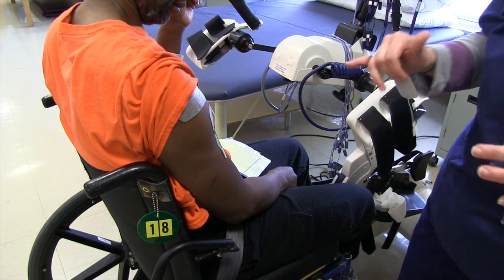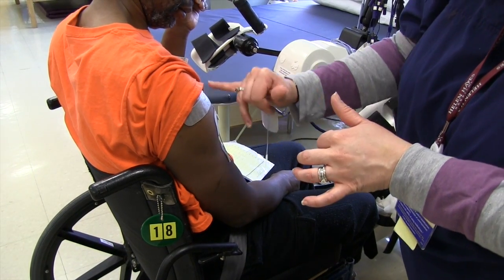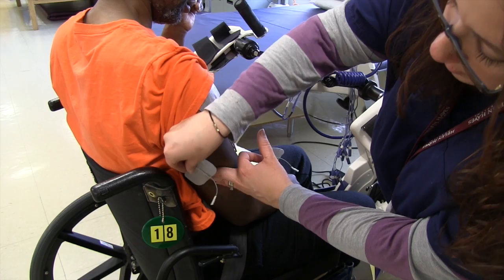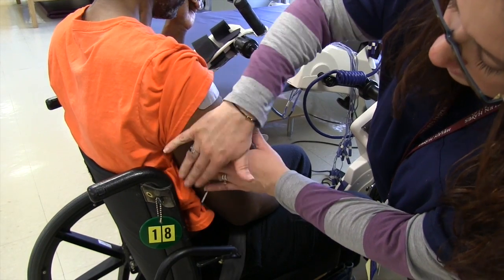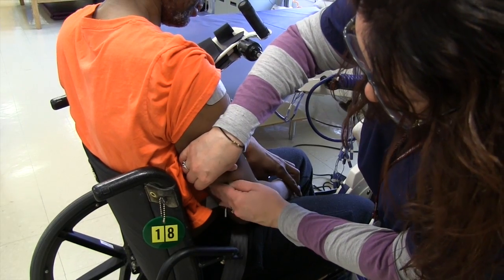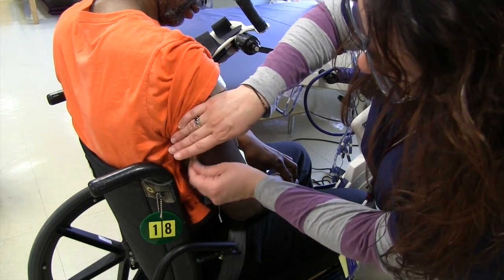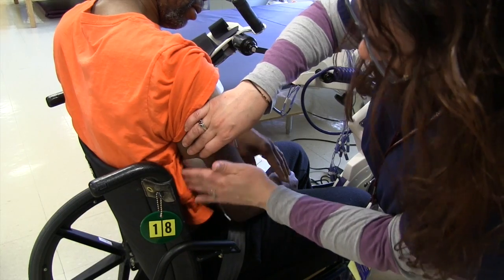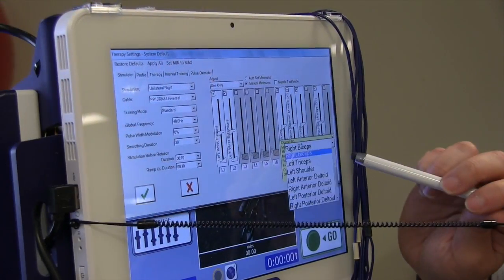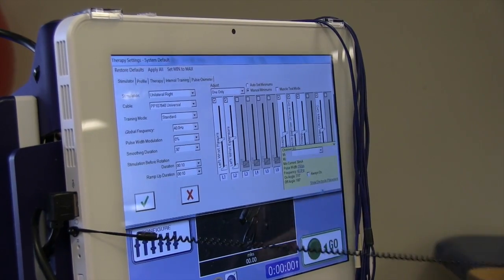I want to focus on the ones that are weaker on him, which are the muscles in the front of the shoulder to reach forward, and then sort of do his triceps, which are back here. He has pretty long arms. Anterior deltoid.